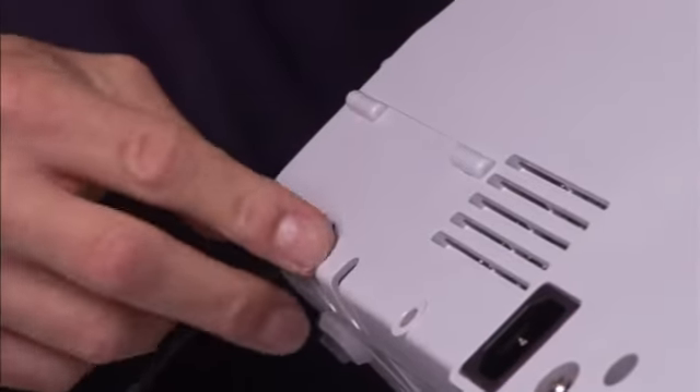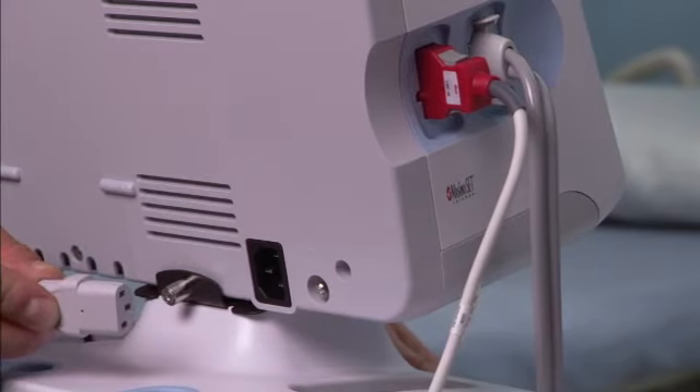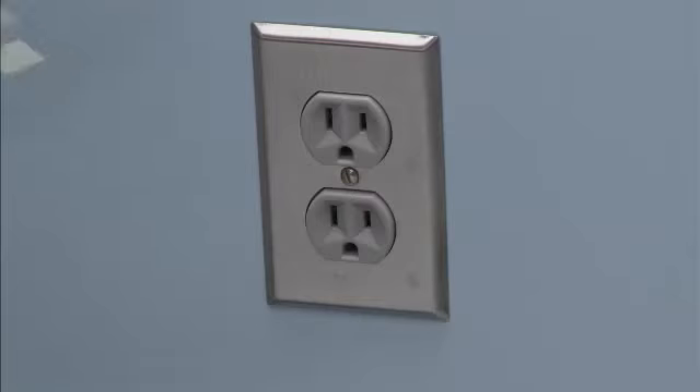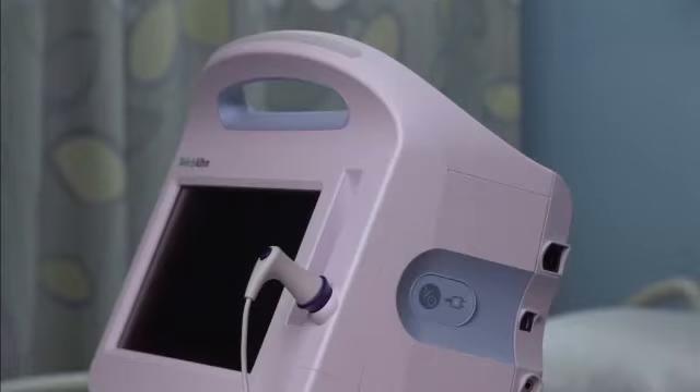Close the door and tighten the screw. You can use the monitor with AC or battery power. To connect AC power, insert the power cord into the AC power connector port on the back of the monitor. Insert the power plug into a power outlet to power the monitor and charge the battery.